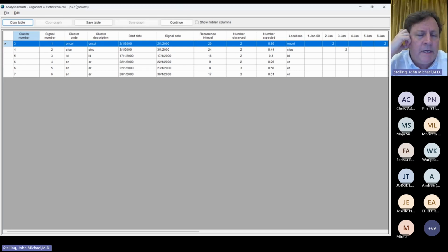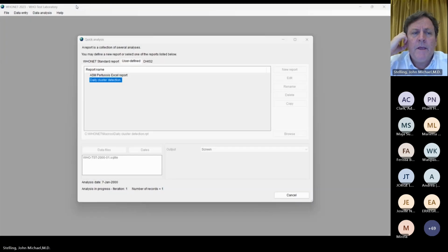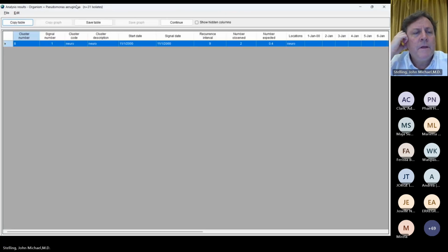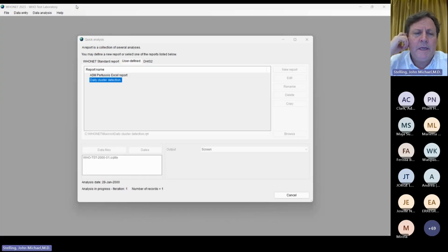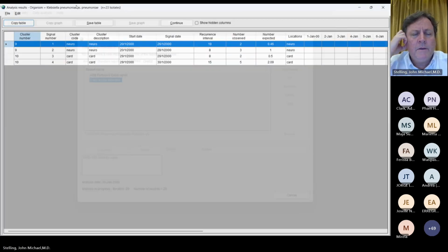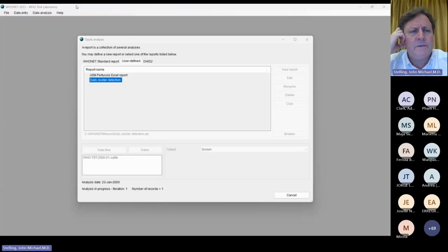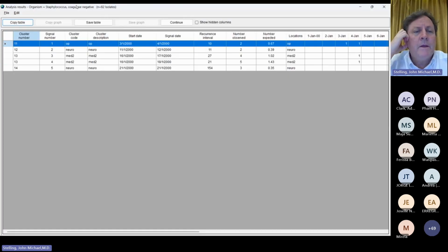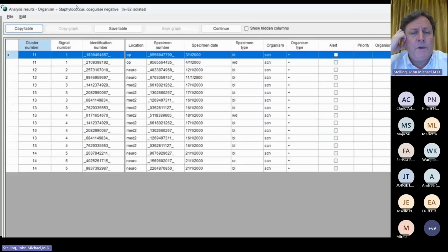So there's no meta location. Everything here was found by individual unit. That is E. coli details, E. coli summary, E. coli list. And then it continues. And now it's Pseudomonas, 1 cluster, 1 summary, the 2 people. I think it's now going to do the Klebsiella pneumonia, detail, summary, listing. I think it's now going to do the Enterococcus or coagulase negative staph, I forget. Yeah, coagulase negative staph, detail, summary, listing.